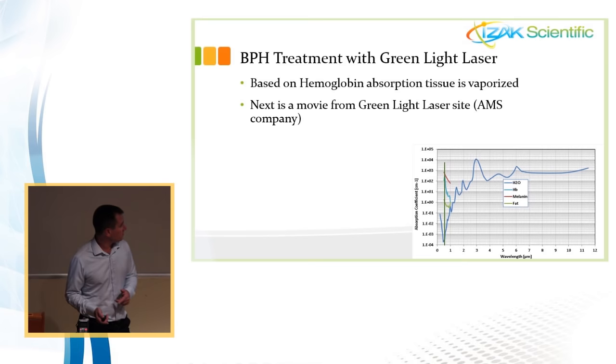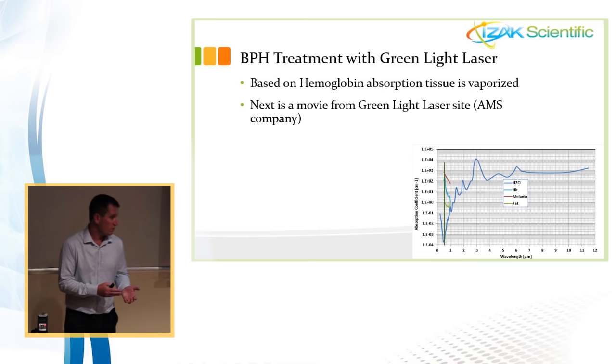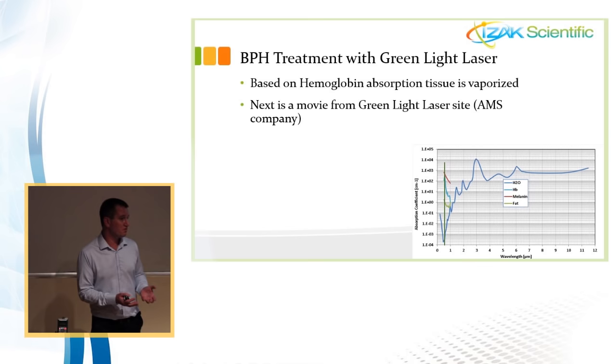The disadvantage is that everything is fluid, there is irrigation, so the fiber needs to be very close to the tissue that we want to ablate. On the other hand, all the tissue is based on water, so it's absorbed and we can ablate the tissue. There are two main applications.